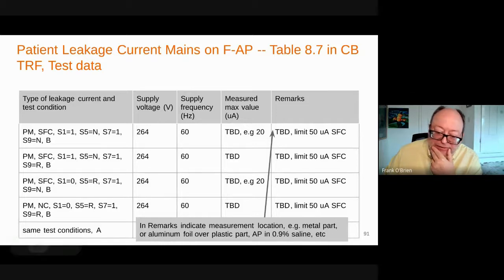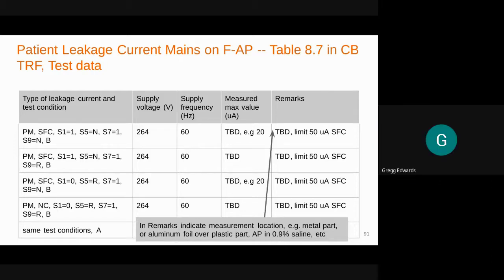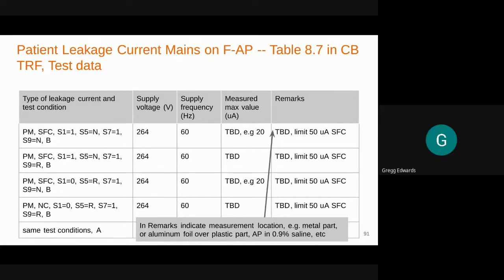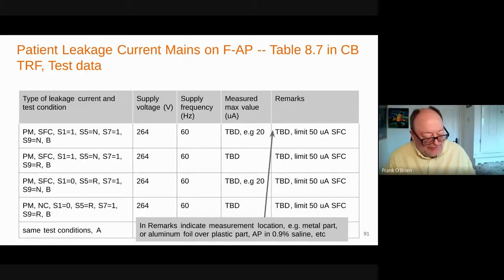And what have you found? Do you have a commercial leakage meter, or do you do your own thing? Well, we have the oscilloscope version in the figure 12 circuit. And then I have a Hioki leakage current tester as well. Oh, okay. The Hioki is a great tool, but I found myself having to verify the measurements with the scope because it's flying blind somewhat. You don't know whether to trust it, and that happens so often. It's always so nice to be able to do a test two ways.